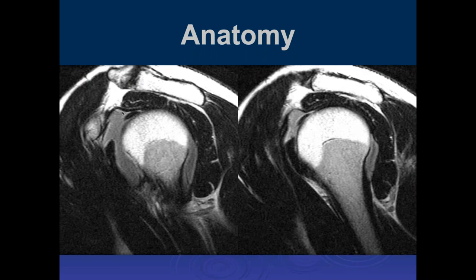Going farther laterally we can see the acromion process shape, the AC joint, the rotator cuff muscles and tendons, and the long head of the biceps tendon in the joint space. With a larger effusion or contrast you can often see the biceps tendon nicely in the sagittal plane. You can follow it from its attachment to the superior glenoid out into the joint space and down into the intertubercular groove — a common location for biceps tendinopathy.